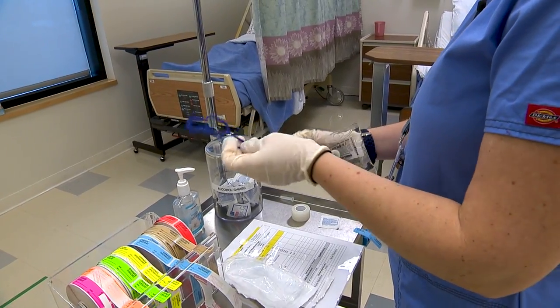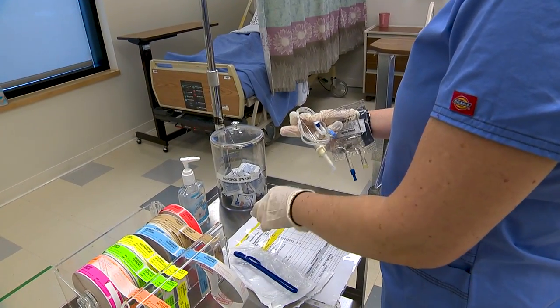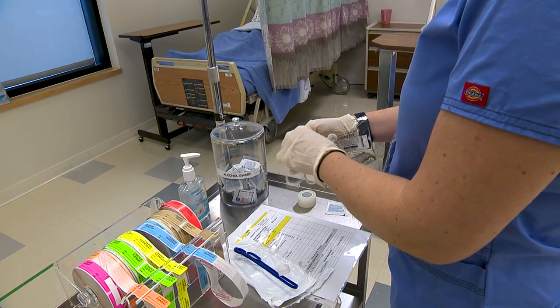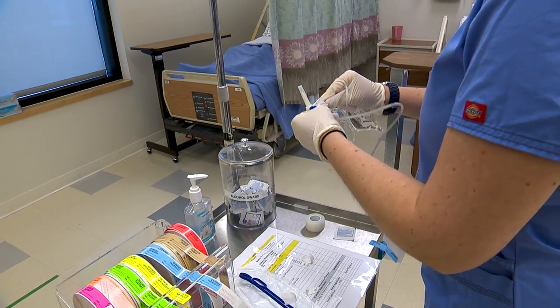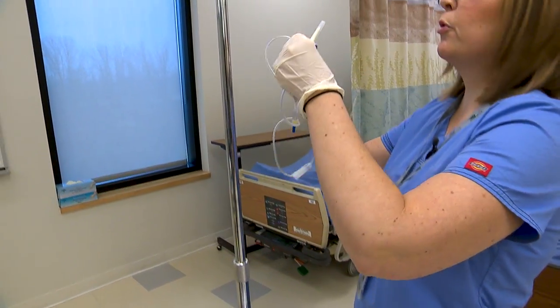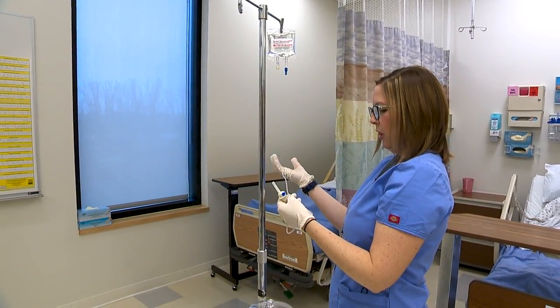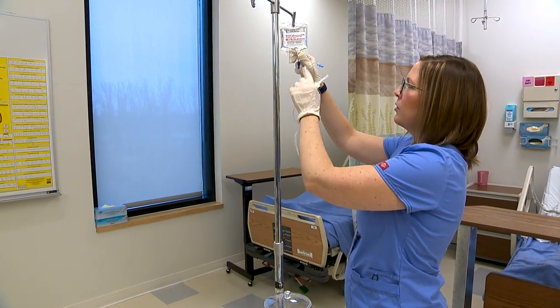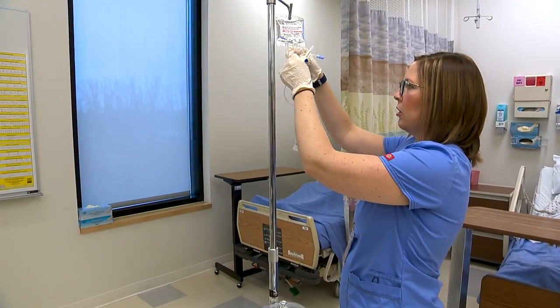So you want to make sure you hold on to this blue plastic hook. We're going to need that when we go in the patient's room. You want to close the roller clamp. Now, if you notice, this tubing is a lot shorter than our previous tubing that we used for the primary line. So you have to be very careful not to race the drug because you have such a smaller volume here. So again, we want to keep this spike sterile.